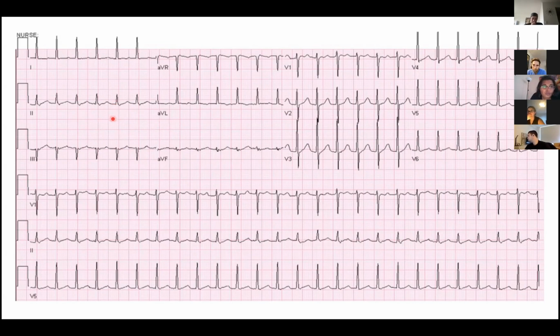So now that we established that, now what's the relationship? Is it P to QRS 1-to-1? Is it more P waves than QRS? I would say 1-to-1. Okay. So now, since it's 1-to-1, you go down your little algorithm, right? And now you measure how soon does this P wave come after the R wave.